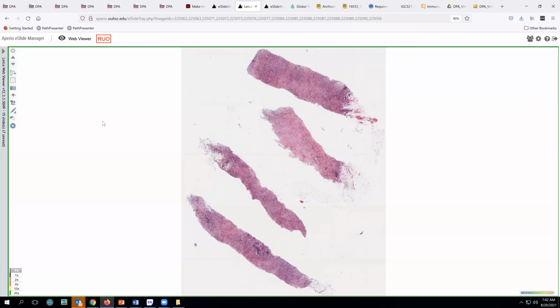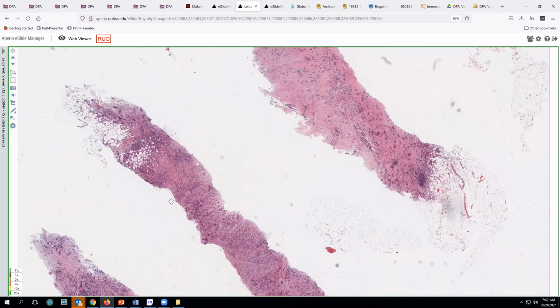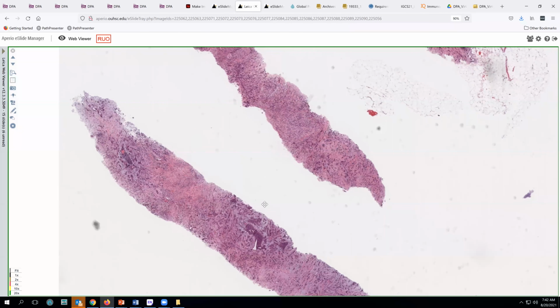One more case here in the breast. As you can see here, this is diffusely abnormal in all 4 cores. I'll mention here that one thing that we also do in management, particularly if there's small or we're concerned about scant tissue, is that we will sometimes divide multiple cores into more than one cassette. So that if we anticipate needing to do multiple immunohistochemical stains, or we have maybe a need to do molecular analyses on something, we've got more than one block that has a tumor in it.